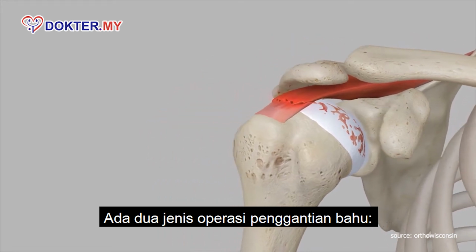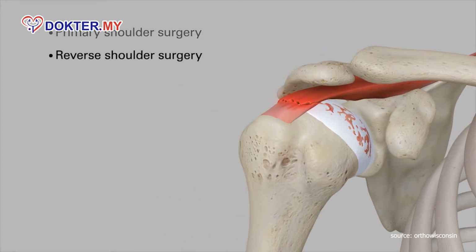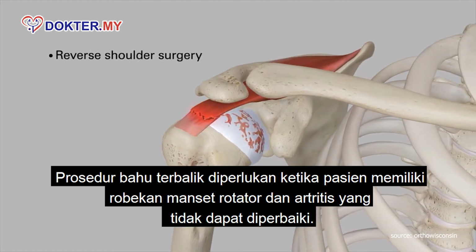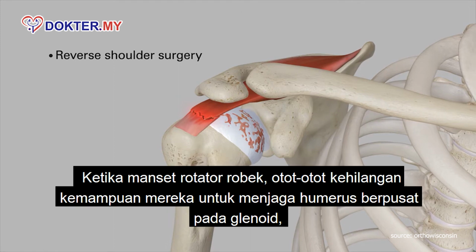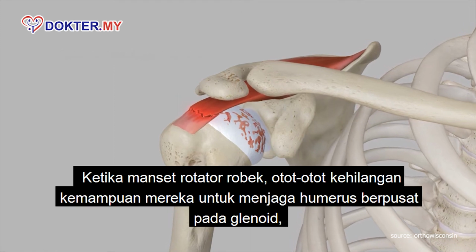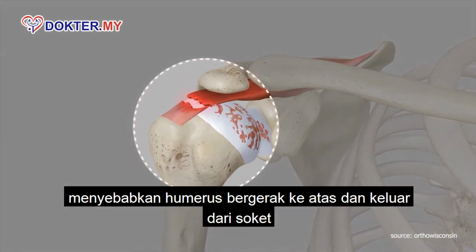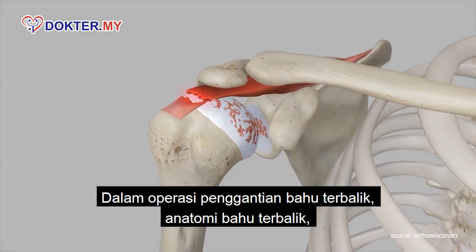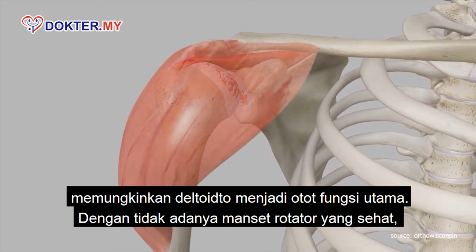There are two types of shoulder replacement surgeries: primary shoulder and reverse shoulder. A reverse shoulder procedure is needed when the patient has a massive, irreparable rotator cuff tear and arthritis. When the rotator cuff tears, the muscles lose their ability to keep the humerus centered on the glenoid, causing the humerus to move upward and out of the socket. In a reverse shoulder replacement surgery, the shoulder anatomy is reversed, allowing the deltoid to become the main functioning muscle in absence of a healthy rotator cuff.